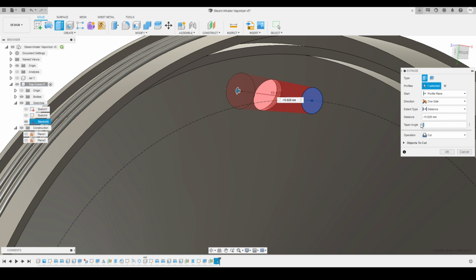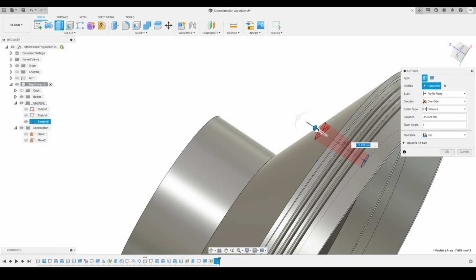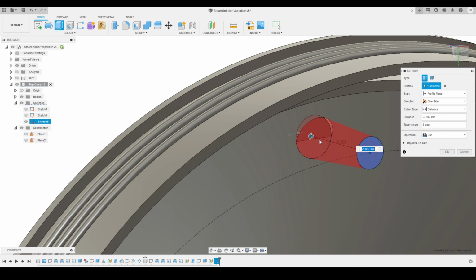So I will just write a little angle over here. I think 3 degrees will work. So it's looking good for now. I'm going to adjust it a little bit. I will make sure that it is passing through the whole profile.